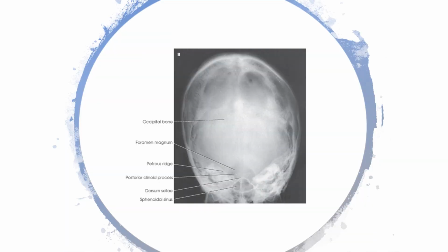All right, so I do have, now this is the Haas projection. This is not the Townes projection, slightly different. And again, I've got them in reverse order. So let me talk to you about the Haas. The Haas is sometimes, it looks like a Townes, doesn't it? It's sometimes called the reverse Townes. It's not exactly the same though.